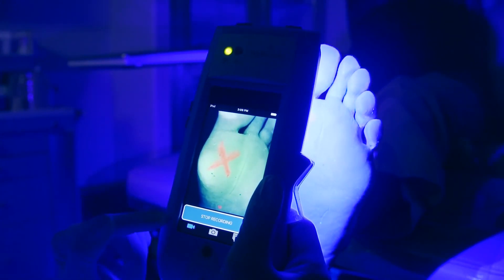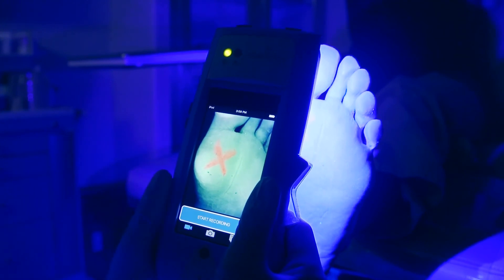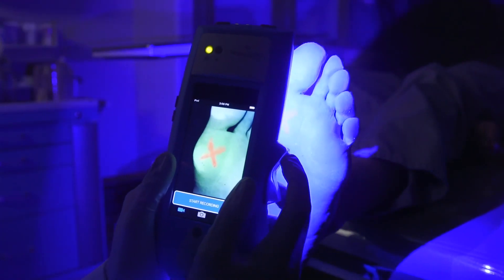Press stop recording when you have all the video footage you need. Then toggle the rocker switch back up to turn off the violet LEDs.